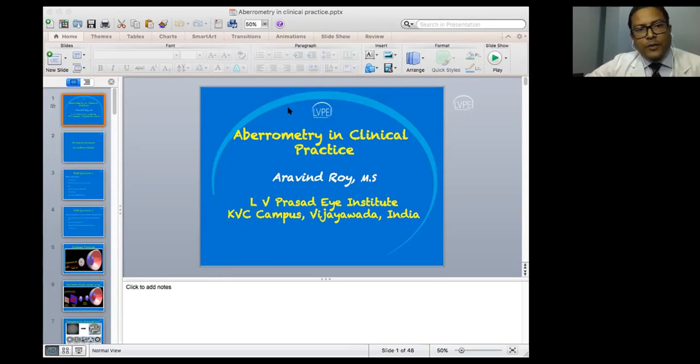Okay, so one more question that is coming up is, what is the use of aberrometry in refractive surgery? This is a very interesting question. So there are two ways of looking at this. There is something called wavefront optimized refractive surgery, and the other is called wavefront guided refractive surgery or wavefront guided ablation. Wavefront optimized ablation is basically that a blend zone is created at the periphery of the ablation, so that there are no abrupt areas of ablated and non-ablated cornea, because the cornea is a prolate spheroid, and those areas which are on the periphery of the ablation may not have the same density of the ablating laser that is being done there as compared to the central cornea. This would be the category of wavefront optimized ablation because there are blend zones.